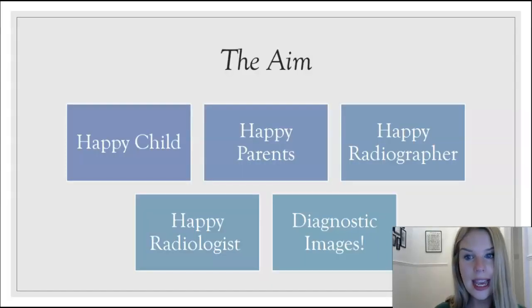Okay, so essentially the aim of paediatric radiography is to have a happy child, but that isn't always the case, because not all children will be in a happy place. They might be in pain, they might be going through some difficult things such as treatment. So although we would like to have a happy child, it's not always possible, but you should always be aiming for that. Make the procedure as pleasant as possible for the child and for the parents. This is quite different from adults, where you're not really dealing with other people, you're just dealing with the patient.